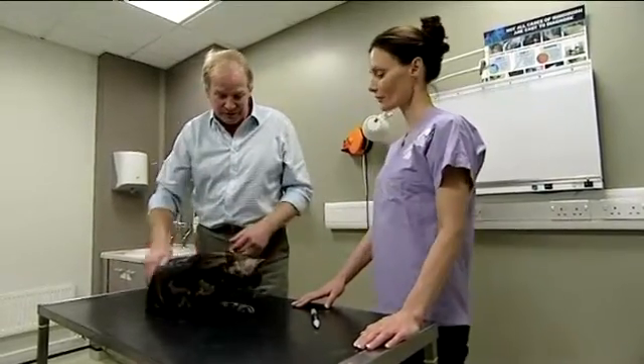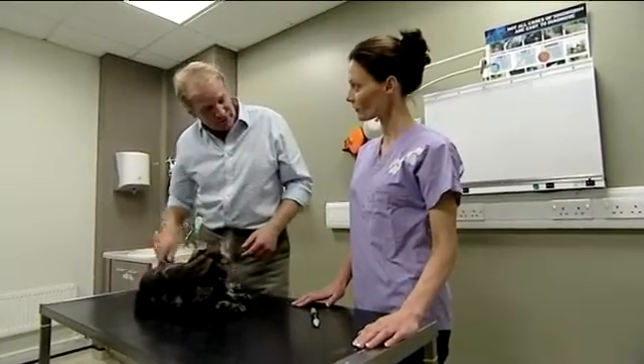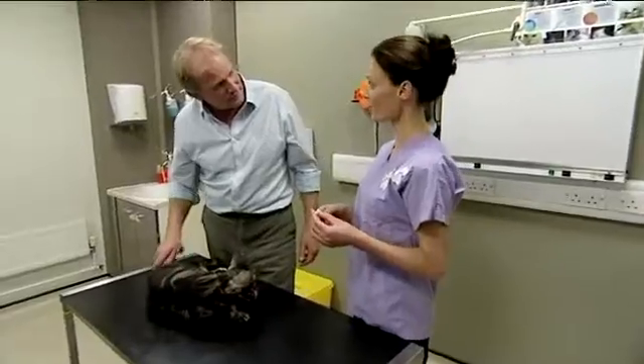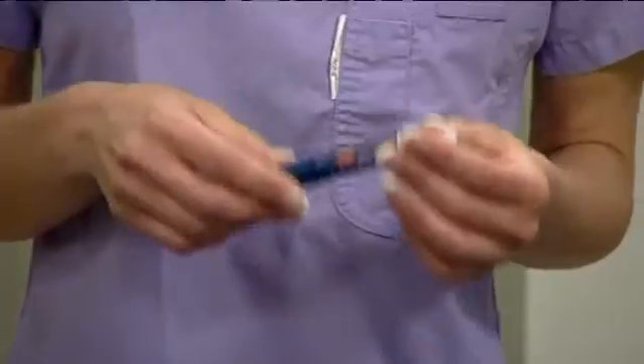But I've got Renata here, who's going to show us how to use the new injection pen, which looks fantastic. Tell me, how does this work? It's a revolutionary new method of administering insulin to your diabetic cat or dog. It's fantastic because it's really easy to use and very easy to administer, and it avoids owners having to use the conventional syringe and needles, which they don't often like.